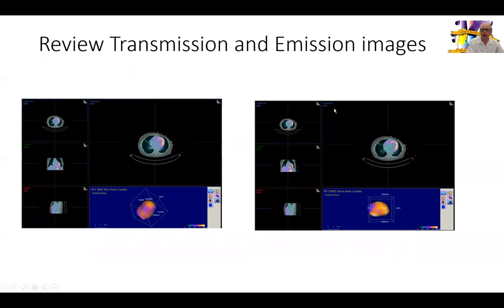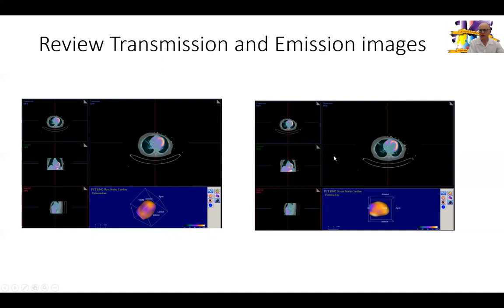We start with the nuclear images. She came to our PET lab, referred by one of my colleagues, to assess the presence of ischemia after the SPECT — which I will share with you later towards the end of the session. This is the rest and stress transmission and emission images. The purpose is to ensure proper co-registration of the perfusion images with the CT images. We have good registration both on the rest images on the left and the stress images on the right.